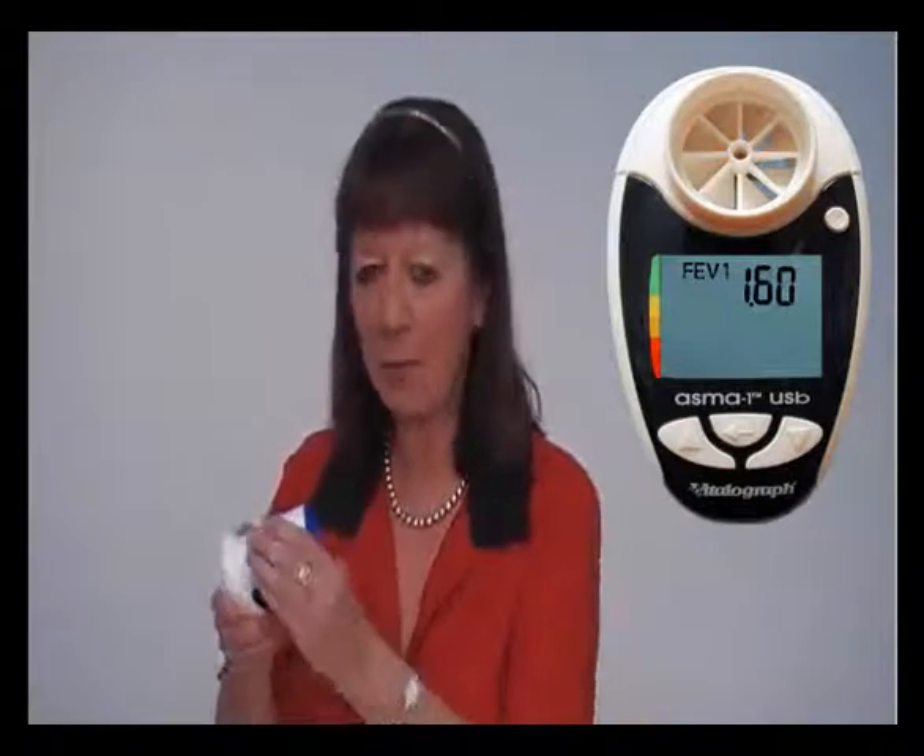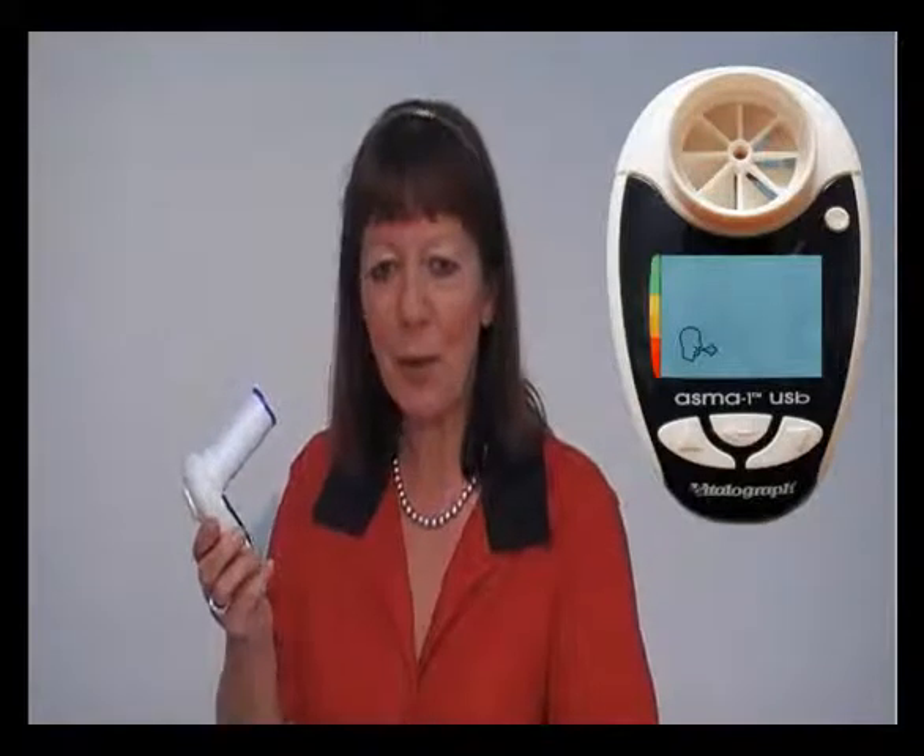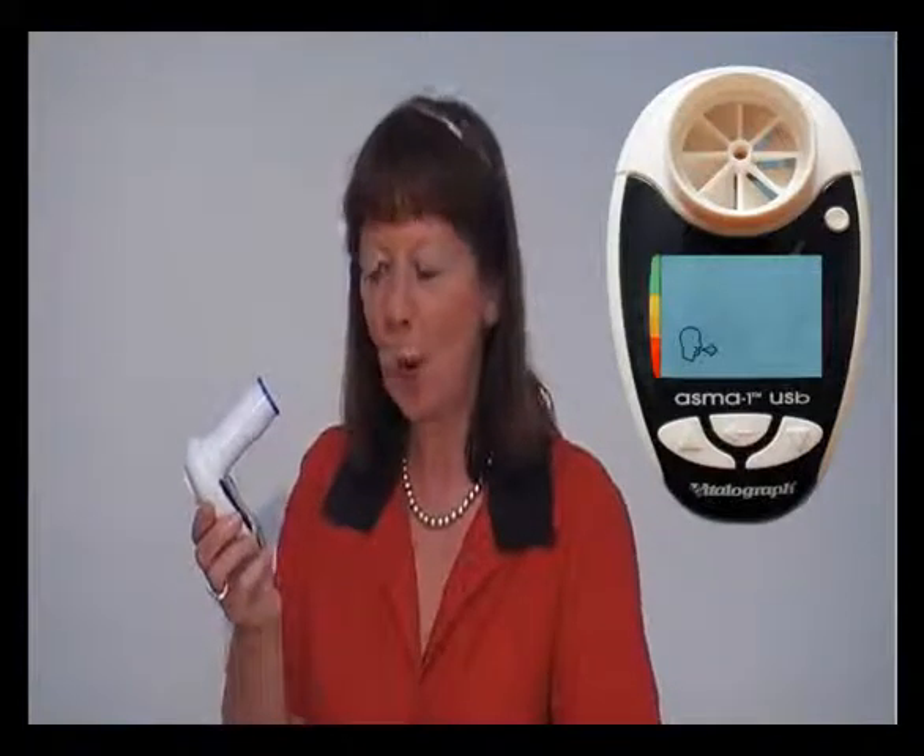Insert a mouthpiece and then use the circular button to switch the AsthmaOne on. You're now ready to perform a test. Take a maximum breath in, lightly bite the mouthpiece with your lips and seal your lips around the mouthpiece, and blow as hard and as fast as possible for more than one second.